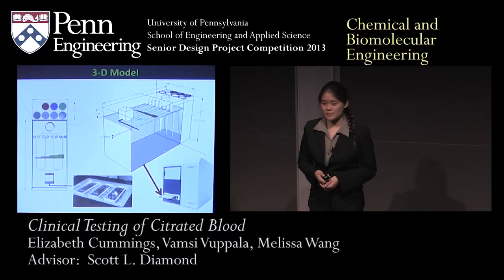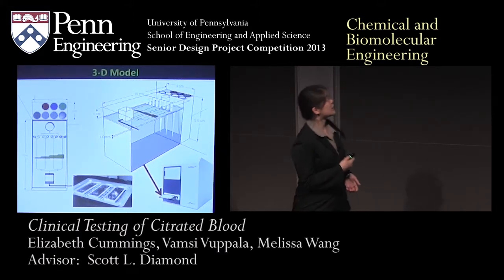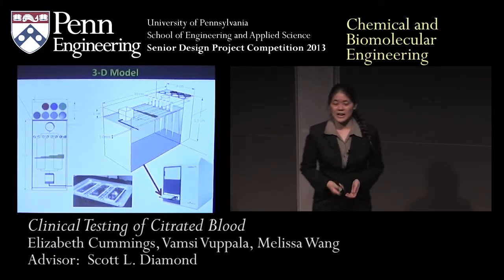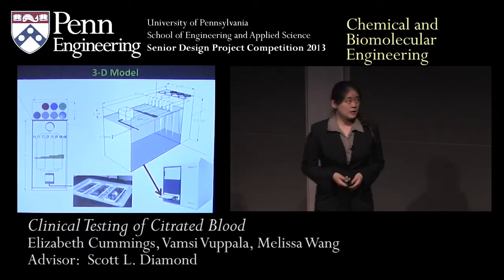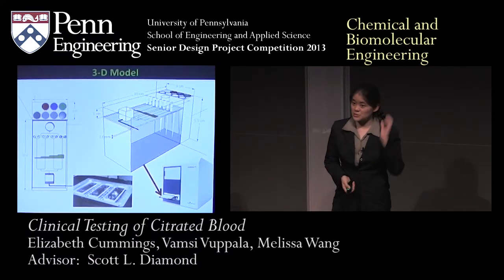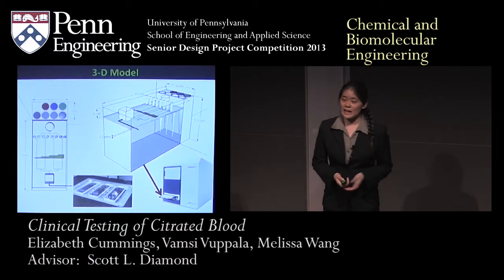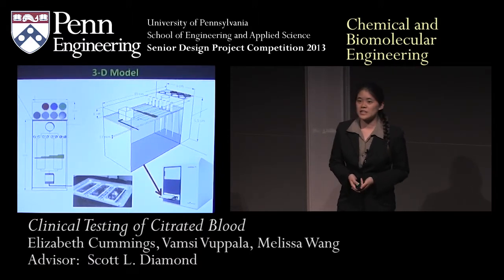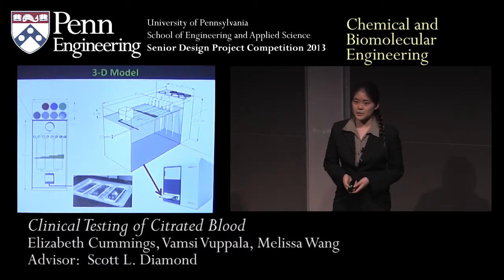The plastic cartridge for the micro-MCA is able to hold 4 pipette tips and has 3 wells. 2 of the wells will contain calcium buffer and fluorescent dye, the 2 reagents that are needed in the analysis process. You can see here a picture of some of the microfluidic devices that we used during lab. The 3rd well is where the doctor will place the blood sample, and after the blood sample has been deposited, the doctor will place the entire device into a processing unit, and the automated analysis process can occur.